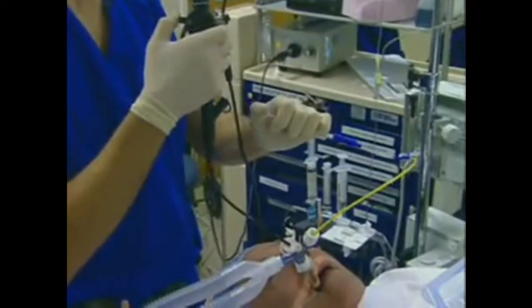Under bronchoscopic vision, the balloon is inflated with air using the pilot balloon assembly. The balloon should fill the entire endobronchial lumen to be blocked and not herniate into the main stem trachea. The lung should be carefully auscultated following initial bronchial blocker placement and balloon inflation to ensure proper functioning of the endobronchial blocker. If ventilation should be acutely difficult during endobronchial blockade, the balloon should be immediately deflated. The bronchoscope can then be withdrawn.